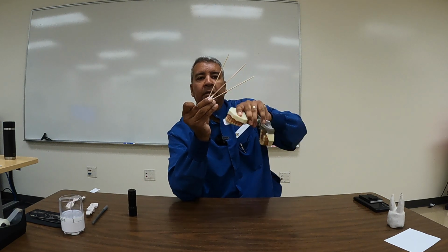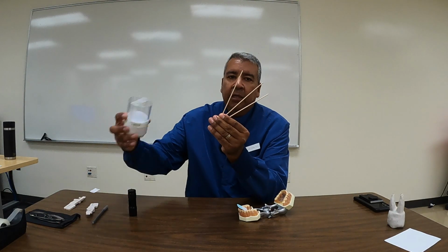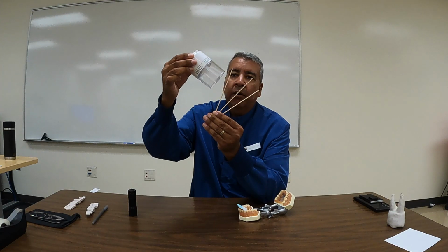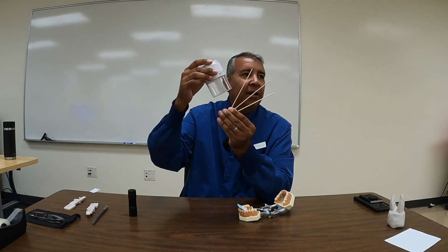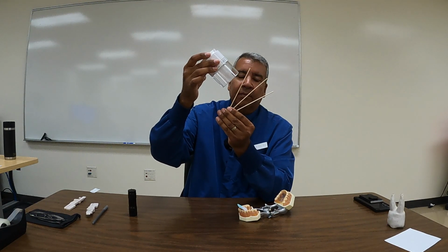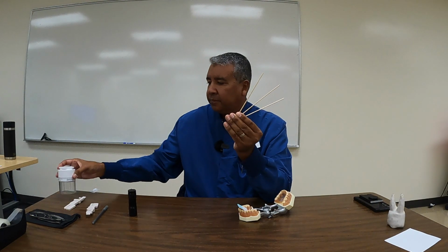Are we good? Okay, so what does that mean to us? Well, we're going to take your PID, and we're not going to be at the angle of the tooth. We're not going to be at the angle of the film. We're going to be somewhere in between to where we are at the vertical angle of the bisector. So this whole technique that you're learning for bisecting is based off of this idea. Where is the bisector? That's how we find our bisector. Questions on that? Okay.